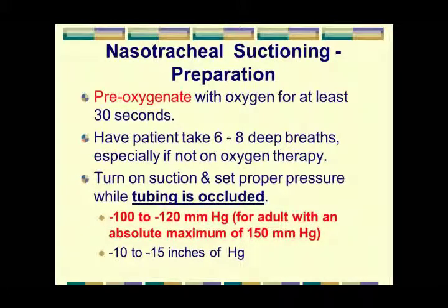Pre-oxygenate them, have them take some deep breaths if they're not on oxygen therapy. If they're on oxygen therapy, you can certainly turn the oxygen up to pre-oxygenate them. Verify the proper suction pressure, and by the way, did I tell you it's 100 to 120 for an adult, 80 to 100 for a child, and 60 to 80 for an infant? Okay, if I haven't, I just told you again now.